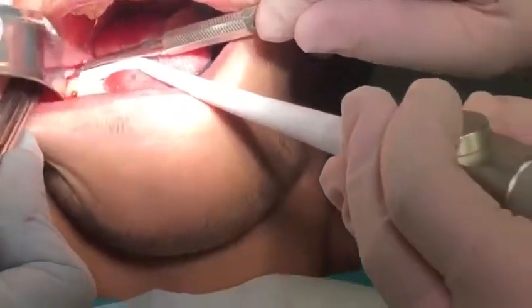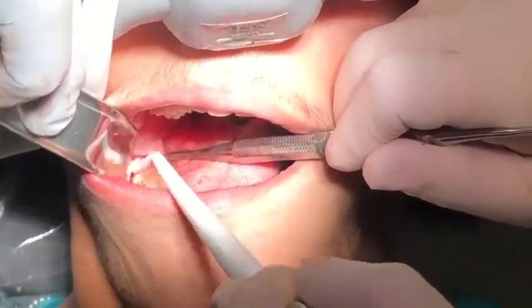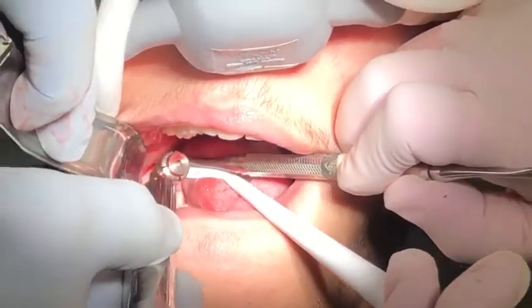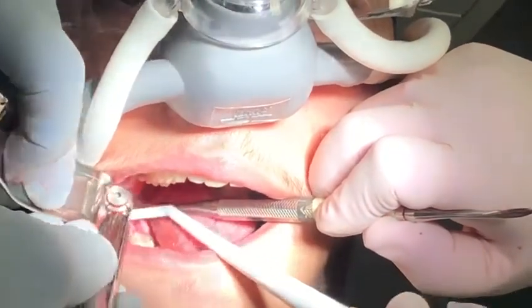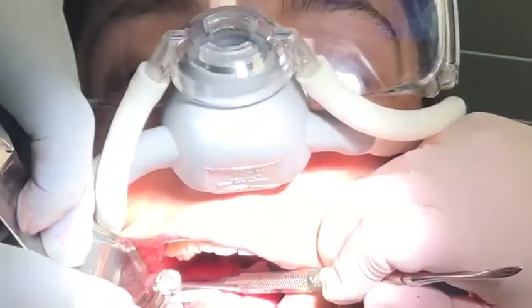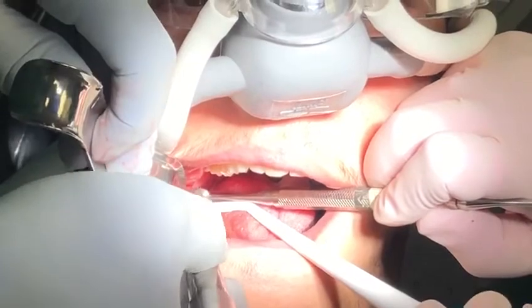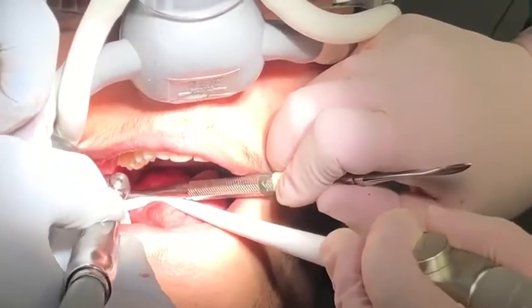We've made a little gutter to create some space. Take your scalpel out for me please — thank you — straight out, and hold it there for me. Great.